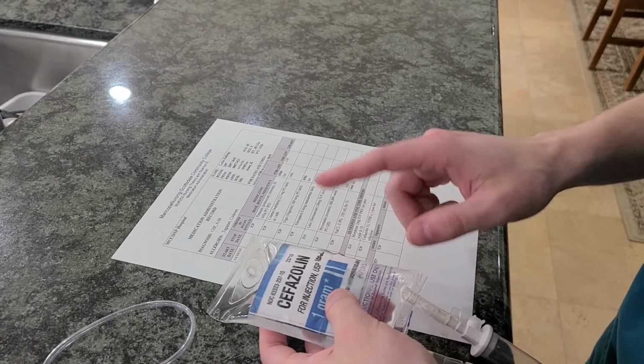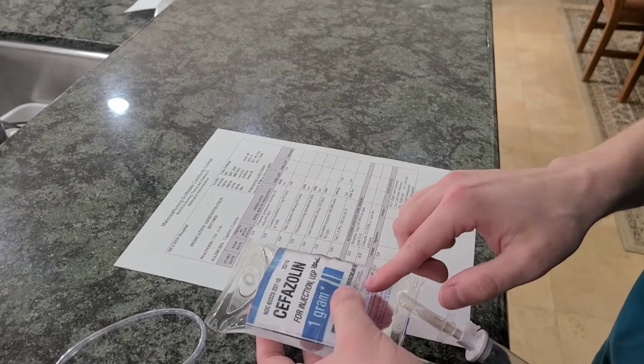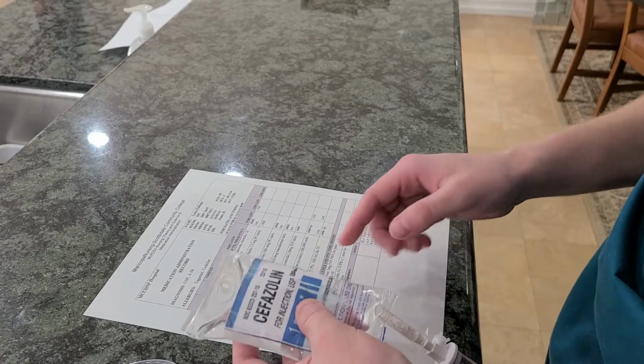Now it's over 100 milliliters, and we calculated the 50 drops per minute, which is about 13 drops per about 15 seconds, and it expires in 2052. So it's not expired, so we're set to give it. It's good to go. And we're giving it at 0800 hours in her right arm.